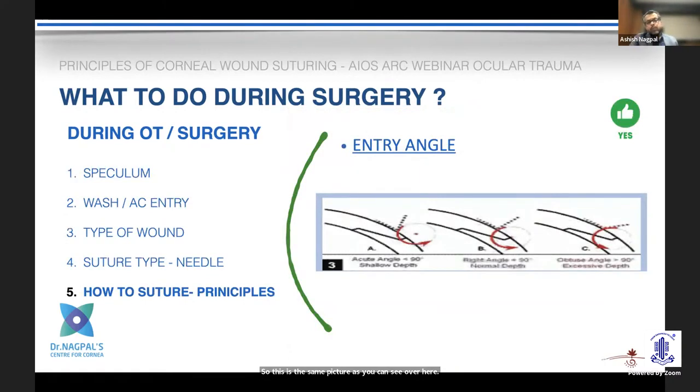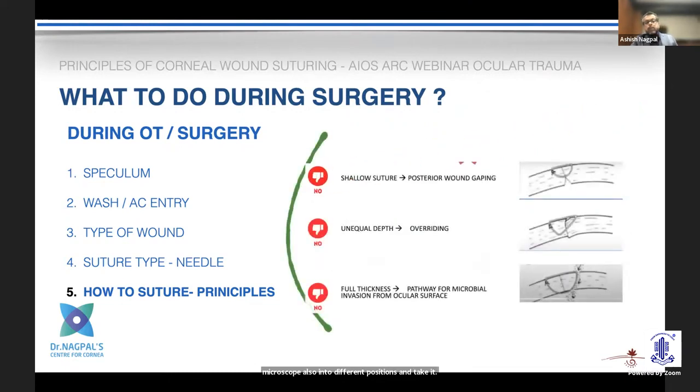Regarding entry angle: if you enter at an acute angle you will end up with a very shallow suture, whereas too obtuse an angle also causes problems. The idea is to go perpendicular to the cornea, so you may need to shift your needle holder, your hand, or even reposition the microscope. A shallow suture leads to unequal depth and tissue overriding. A full-thickness suture carries a risk of microbial invasion and contamination, so we avoid full-thickness sutures in most corneal surgeries.